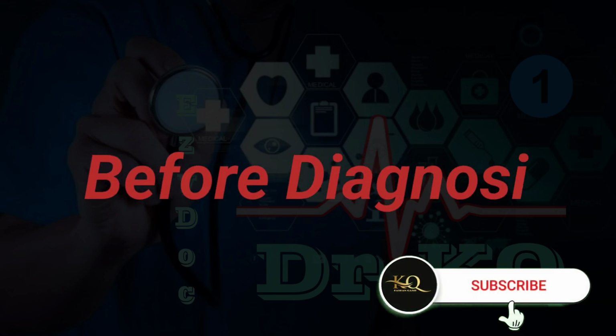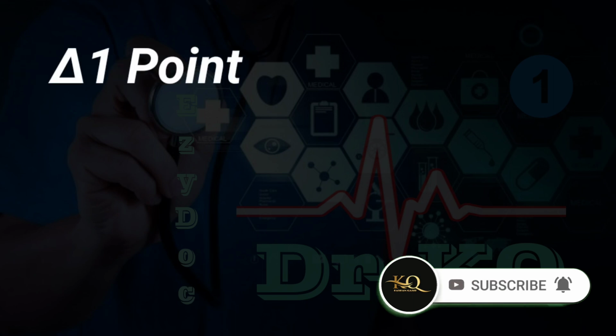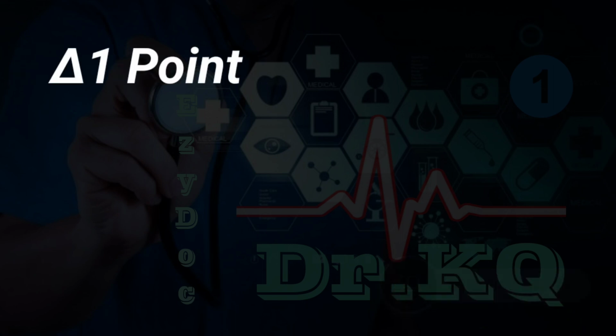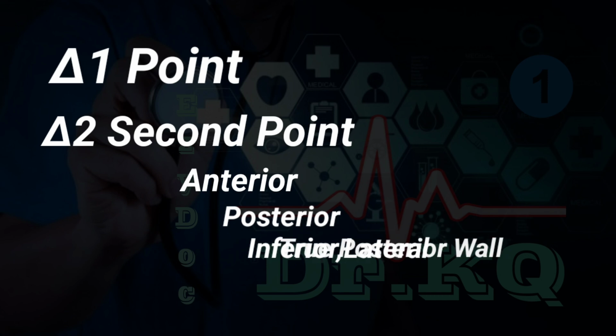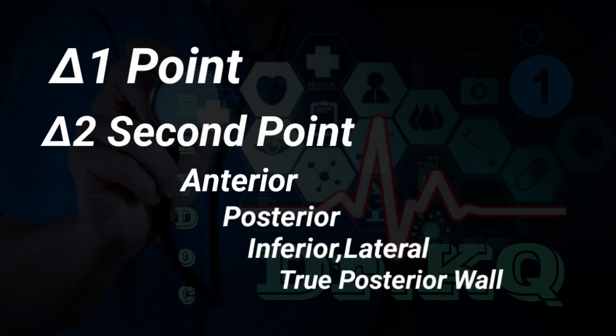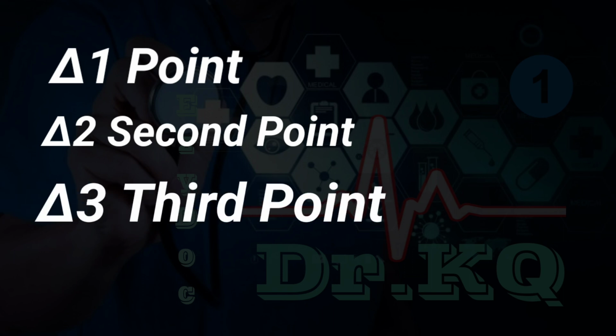Before going to diagnose the myocardial infarction, remember the following points in mind. Number one is the criteria of infarction. Second is the site of infarction, which can be anterior, posterior, inferior, lateral or true posterior wall MI. Whatever the site is, you can get a clear view after looking at the ECG. Third is the recent or old MI.